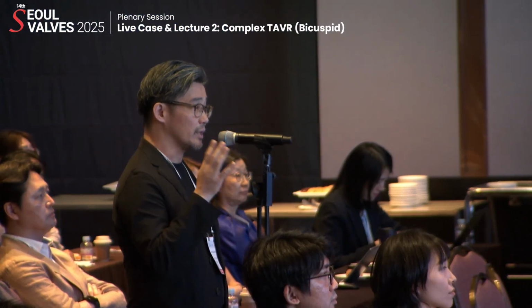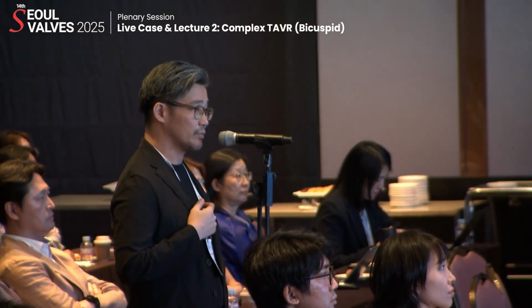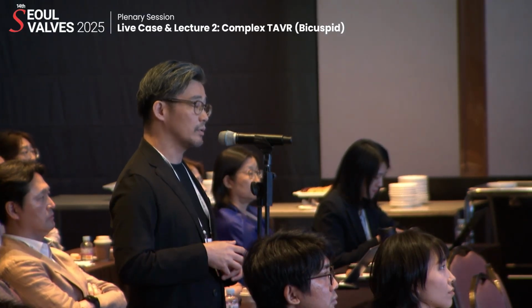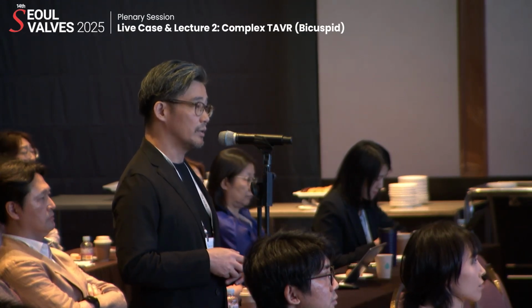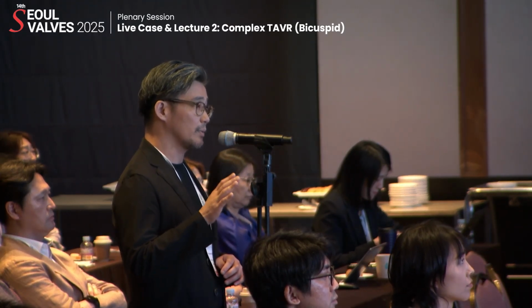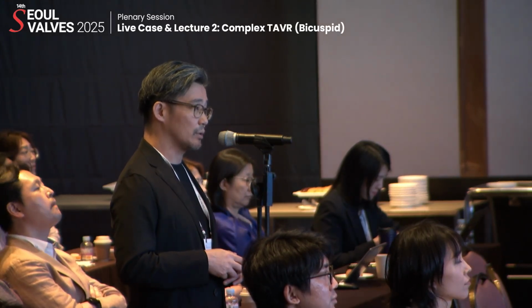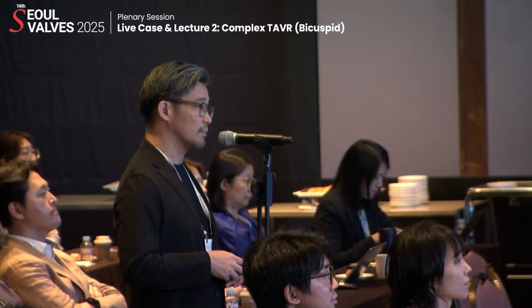If we perform post-dilatation with the same volume, usually it's safe, but sometimes it might cause some risk of aortic rupture because it expands much more. So if there is a need for post-dilatation, I would proceed. For example, if there is some unacceptable PVL or maybe residual pressure gradient. So I don't do routine post-dilatation with the same volume.